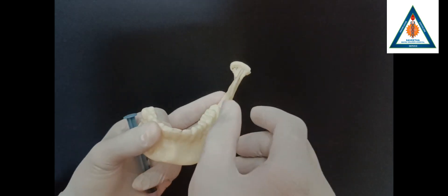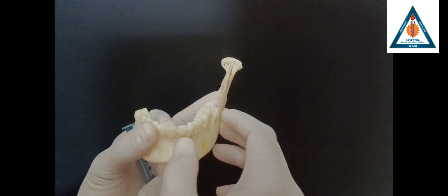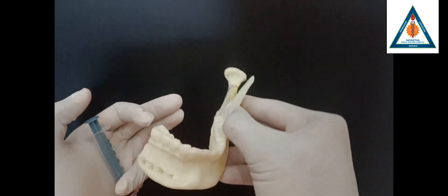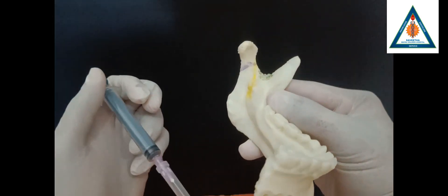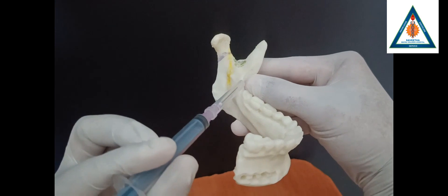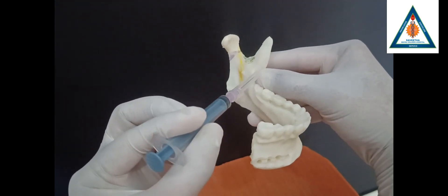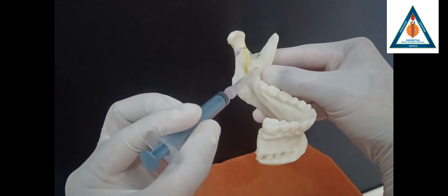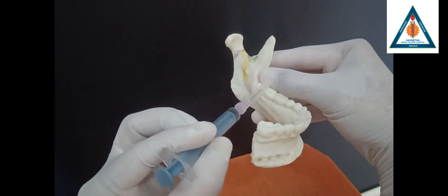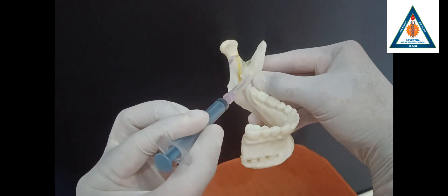First, height of the needle insertion. How do you determine the height of the needle insertion? You palpate the coronoid notch, then consider an imaginary line over the thumb finger. This line has to be 6 to 8 mm above the occlusal plane of the molars. That determines your height.